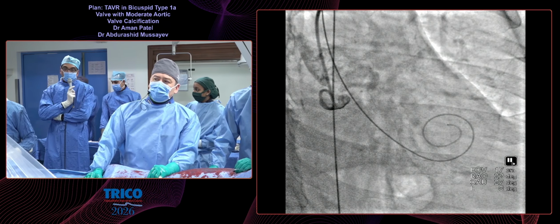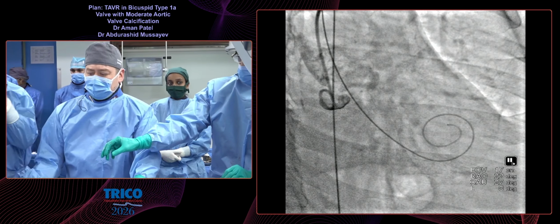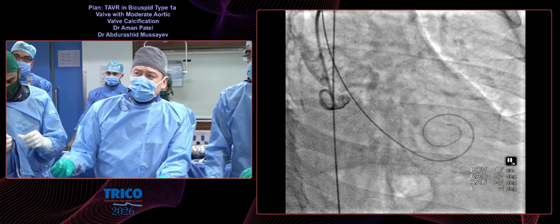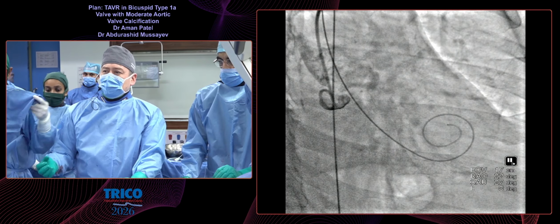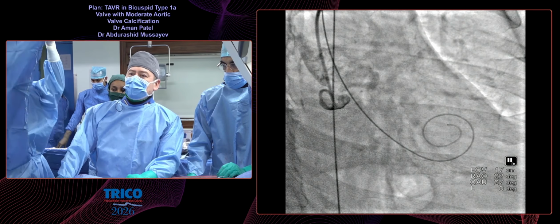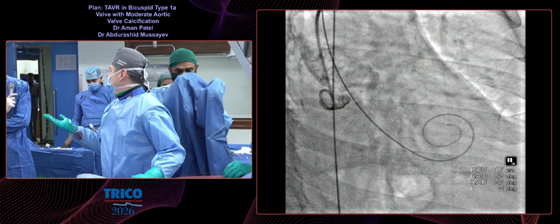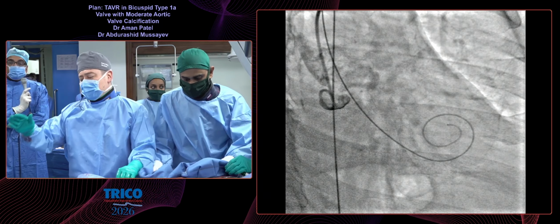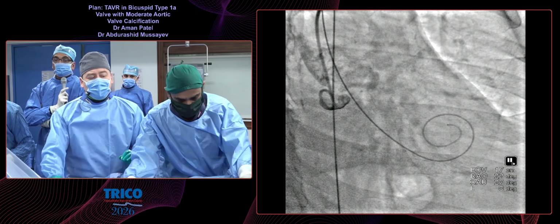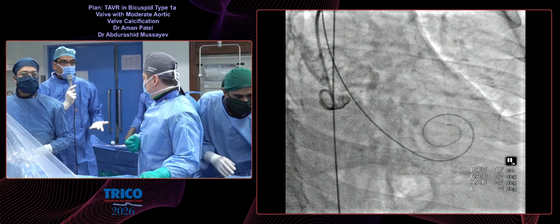But yes, the main aim of predilation is to create some space for much easier valve crossing with the transcatheter heart valve. But here, I think we could cross very easily. The angle of the aortic root seems good, and there shouldn't be any problems with valve crossing. But as you mentioned, my main concern is about the PVL.